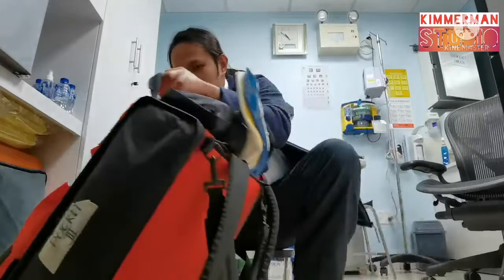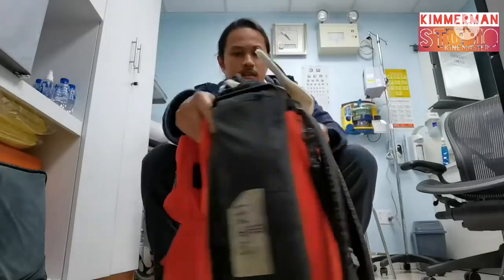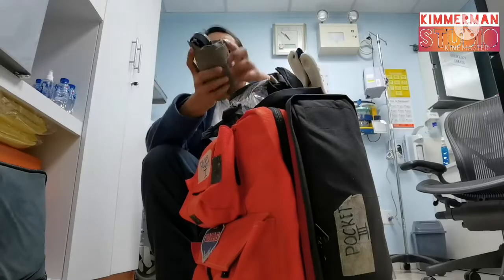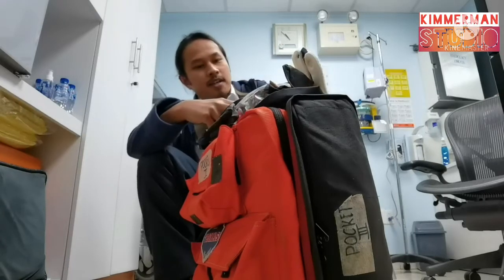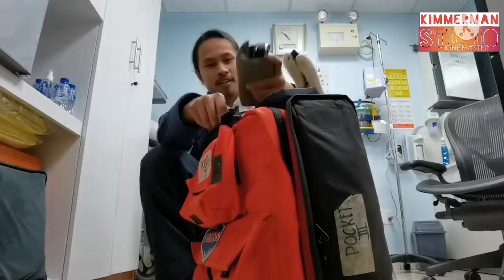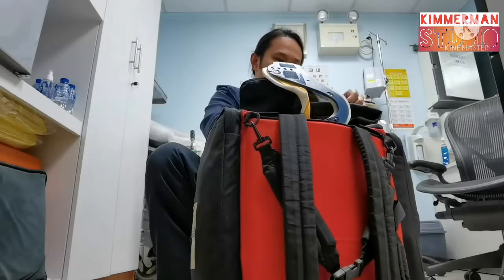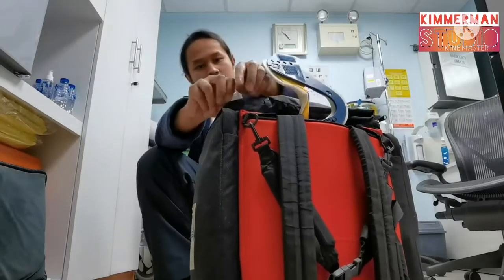We'll start with pouch one. In pouch one you can see the BP apparatus, the BP cuff, your stethoscope, shears, and flashlight or pen light — though I have my pen light in my pocket. These items should be put here in pouch one. Pouch one — check.